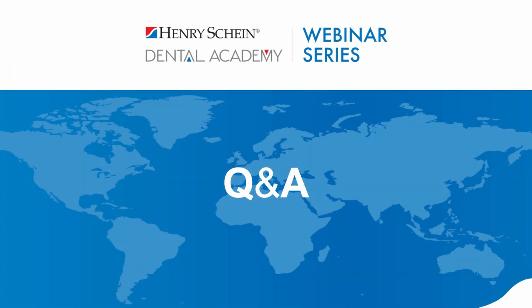Thank you. Great presentation. The first question is: is the Purevac heavy, where it creates drag and hand fatigue? You know what? The Purevac is not heavy. Okay. It is not heavy. I think one of the things I've got to be honest about is that I took the hose and I actually cut it because it's pretty long and you've got two little hoses that kind of go down. I like that device, but one of the things you can do is actually trim the hose, right? So that helped. But as far as holding it, no, it was not heavy at all.